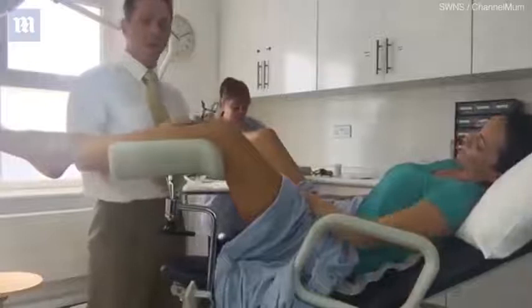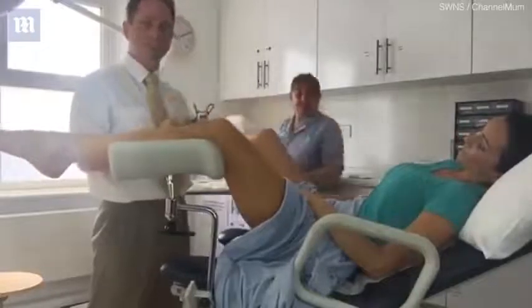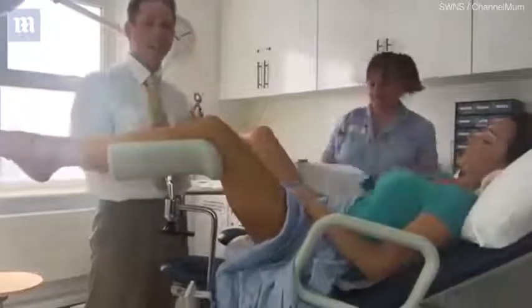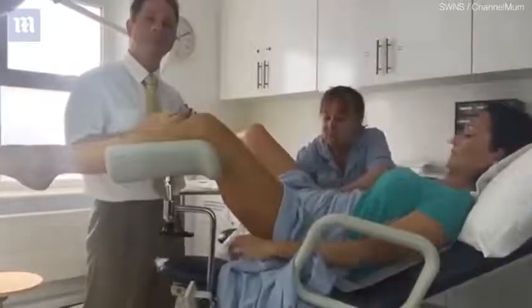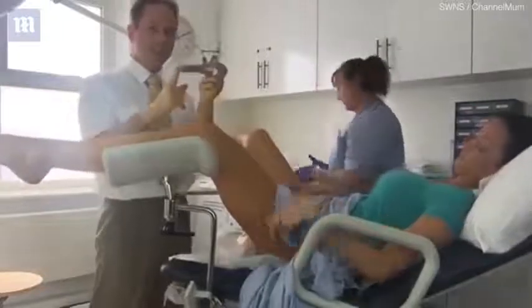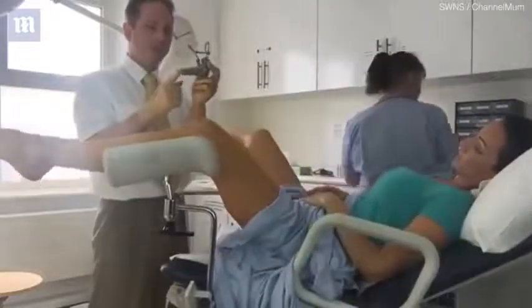So to do a cervical smear, as you would imagine, you have to look at the cervix, and that sits at the top of the vagina. It's the neck of the womb, the neck of the uterus where the baby lives and where your periods come from. To do that, one needs to use an instrument called a speculum. That is a speculum there. I'm sure many of you are familiar with it.